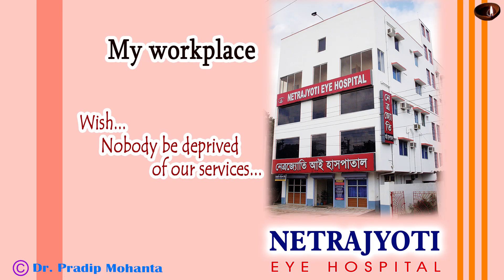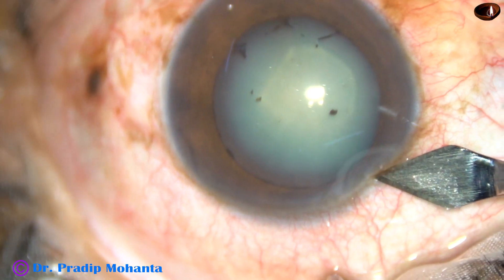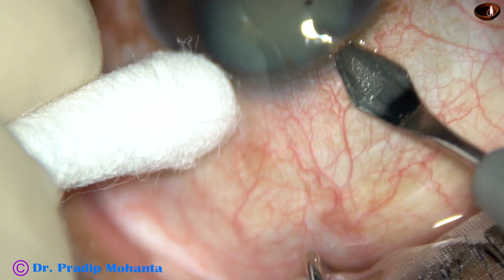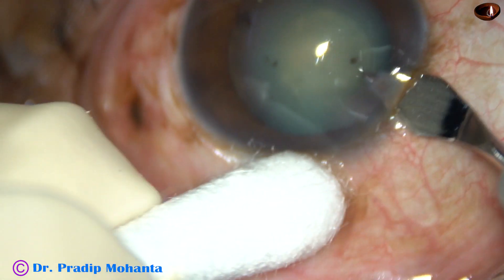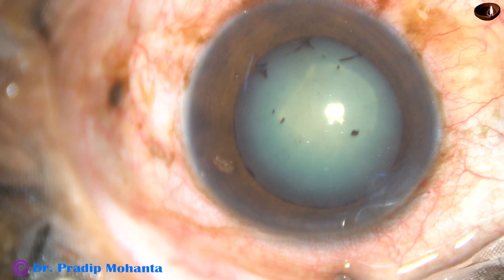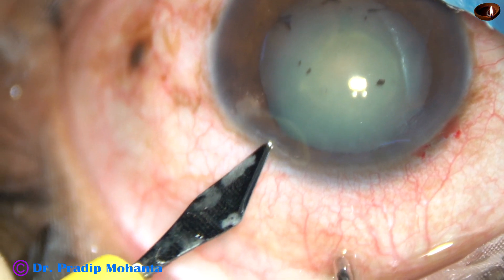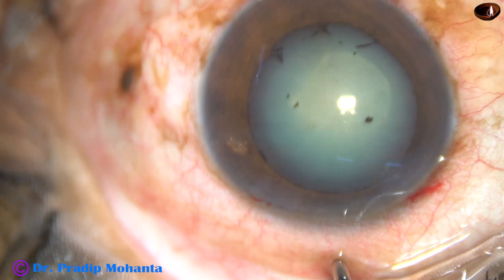Dear colleagues, welcome to my hospital at Ranaghat, West Bengal, India. This is a white non-mature cataract with a denser patch in the posterior aspect of the cataract. At this moment, I do not know whether it is a posterior polar cataract or not. However, I have to take all the precautions that are taken in a posterior polar cataract. So I have taken this case for surgery. Let us observe these surgical steps.